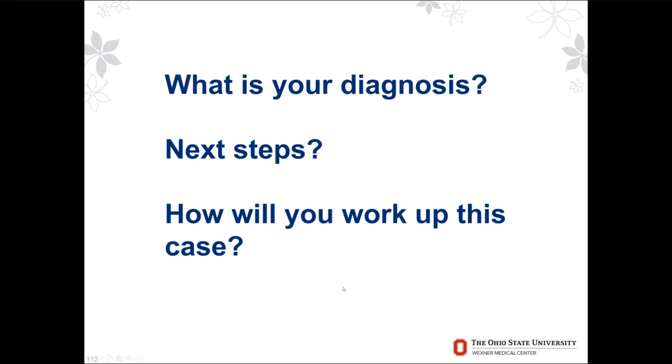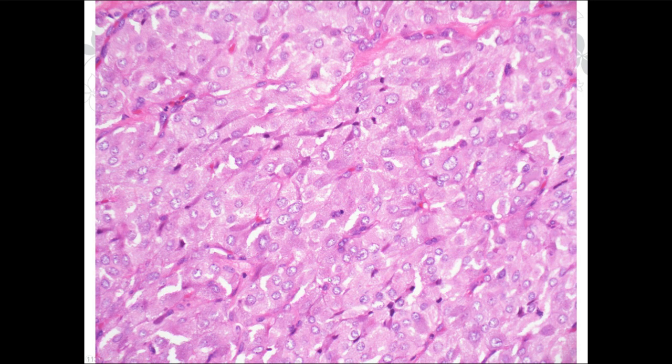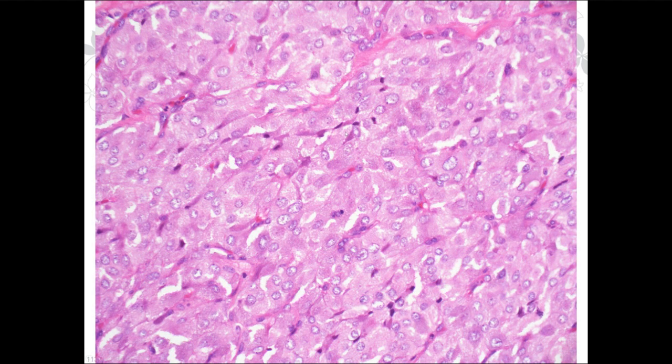So what do you do? What is your diagnosis? What are the next steps? How will you work up this case? So looking at this, what is the question that should come to your mind? If you look at this, you notice that there is somewhat of a vascular pattern to it. There is somewhat of a nested pattern to it.